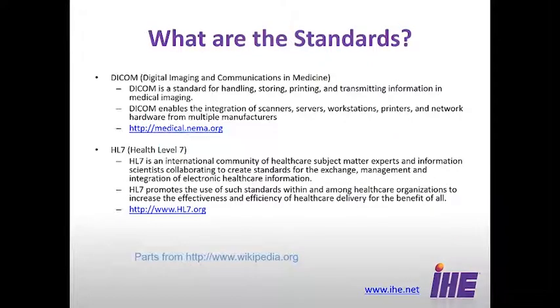interoperability issues or problems. Now, IHE does not write standards. What we do is refine standards that exist, and the two main ones we work with are DICOM and HL7. I would imagine that most people are familiar with those, but if you wanted to learn more, there are links on the slide, and these slides will be available later on. They'll be posted online on the IHE website.